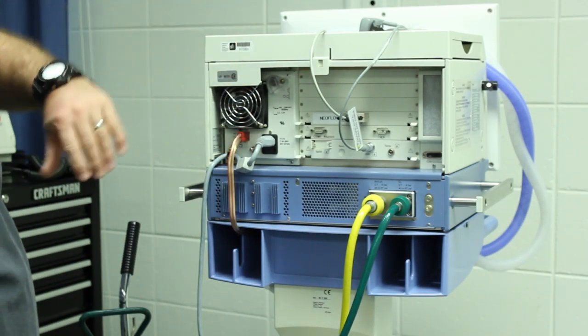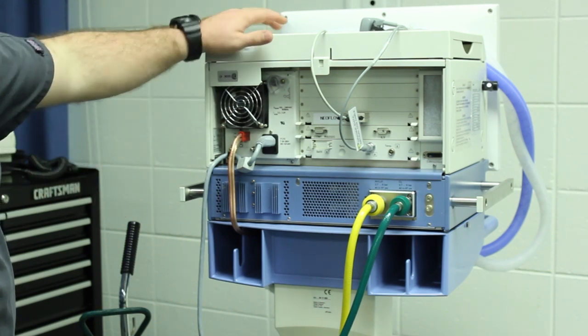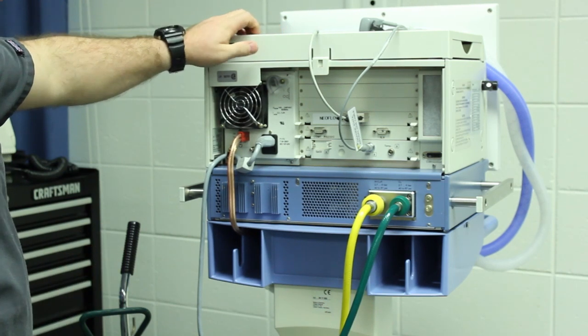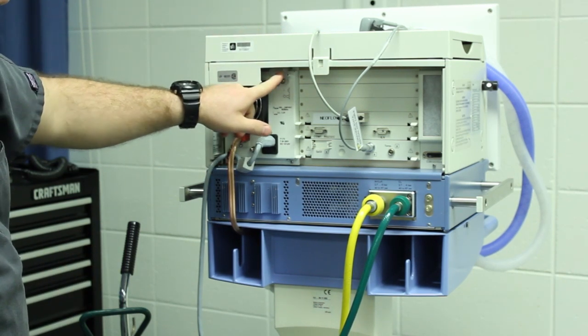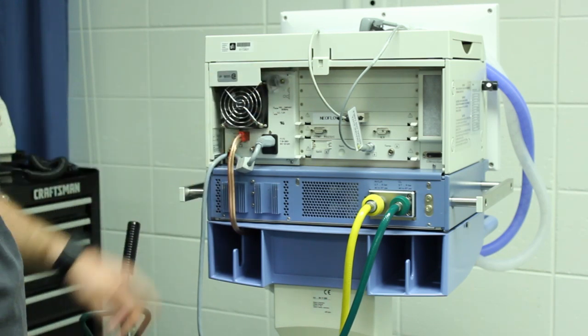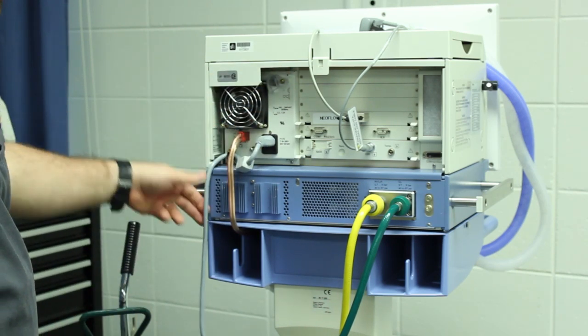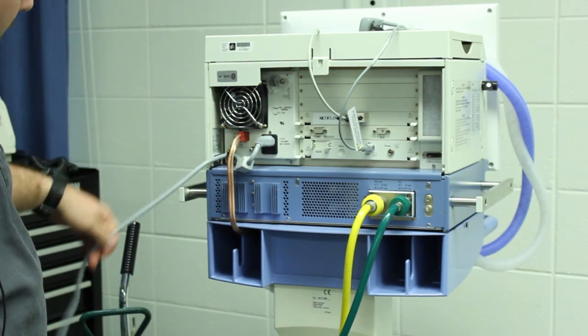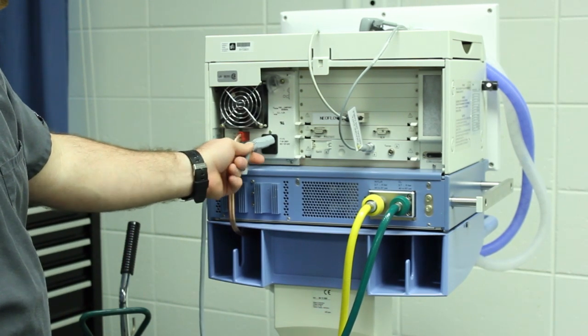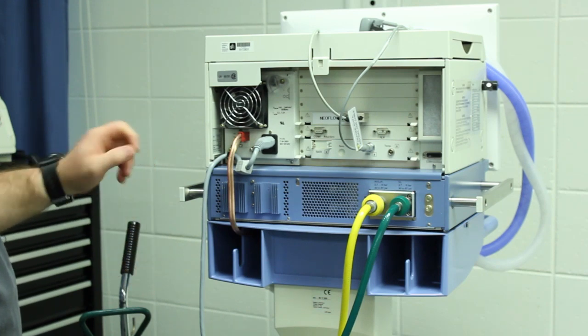This is the instructor video for the back of the Dräger ventilator. Starting at the top, the on/off switch is right here — lift the little tab up and push it in to turn it on. This is your AC cable to plug it in. This cable can come undone, and we've seen it happen before, so if you're turning it on and it's not doing anything, that's probably the problem.